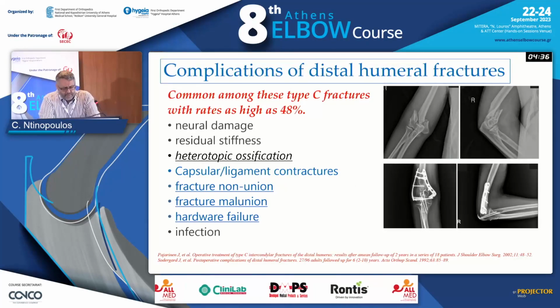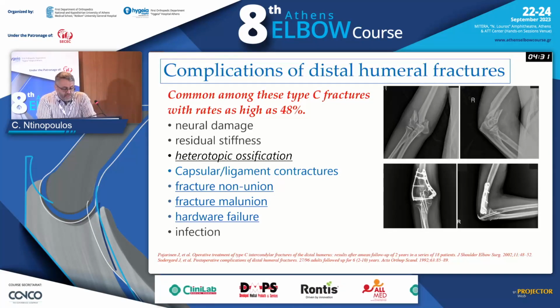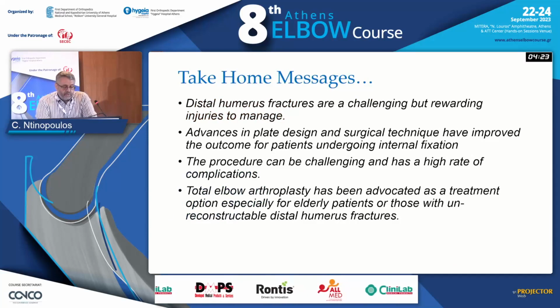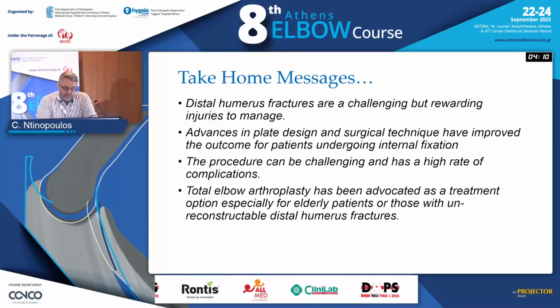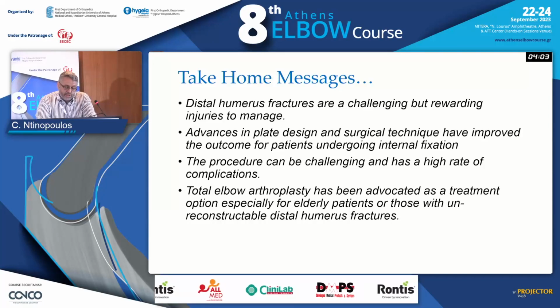Complications, many, too many. Up to 48% in C-type fractures in the literature. The problematic contractures and elbow stiffness, non-union, malunion, hardware failure. What to remember? Challenging fractures. Although we have advances in plate design and we have very nice implants, surgical technique will improve the outcome of patients undergoing internal fixation. The procedure is challenging with a high rate of complications. Total elbow arthroplasty has been advocated as a treatment option, especially for elderly people. And thank you very much.